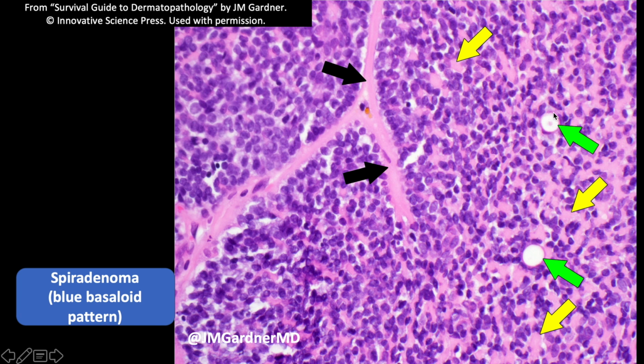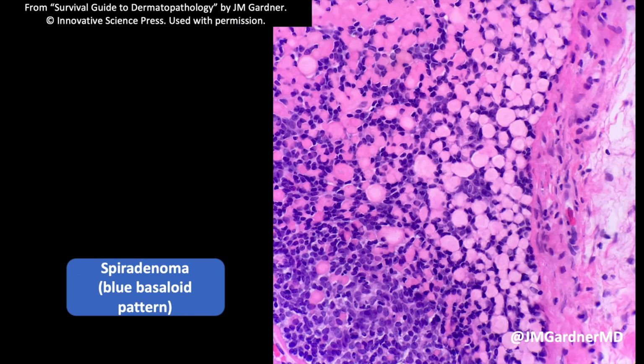Now, these ducts don't have their own cuboidal lining, but they have a very sharply circumscribed border and this thickened, darker pink layer around that border that we call the cuticle. So the presence of a dense pink cuticle, sharp circumscription, and if you're lucky, a little droplet of sweat secretion in the middle, that's helpful to distinguish a true duct from an artifactual vacuole. And sometimes that distinction can be challenging.